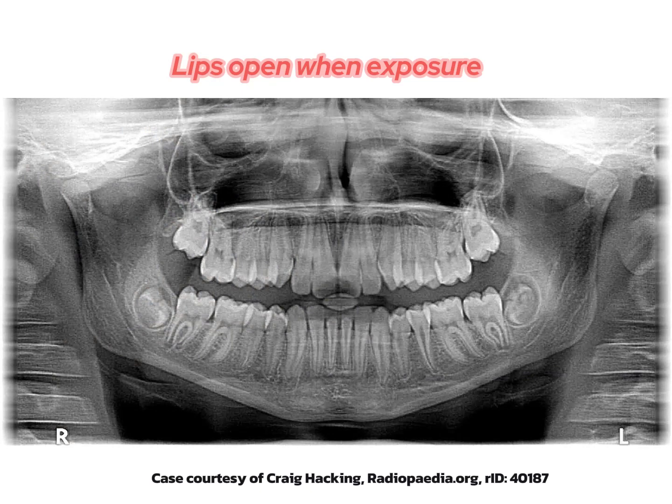Lips did not close. A dark radiolucent shadow results that obscures anterior teeth. This area of increased darkness occurs over the maxillary anterior regions and may be mistaken for bone loss. To correct this error, the clinician must instruct the patient to close the lips around the bite block.